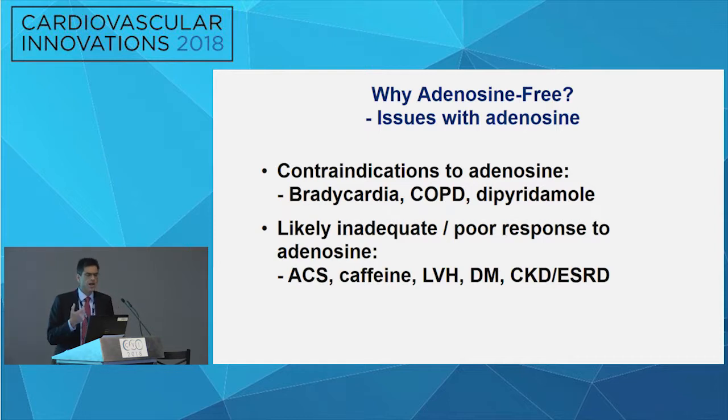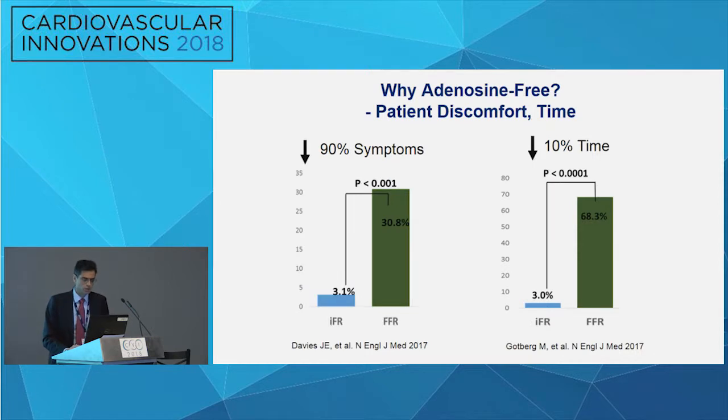But the reality is, for IC adenosine especially, the chance of getting this is fairly low. But nevertheless, why push it? And with the resting indices, you can do this as well. You've heard that obviously if you do the resting indices, you are going to be faster, and you're going to make the patient not have to feel bad.